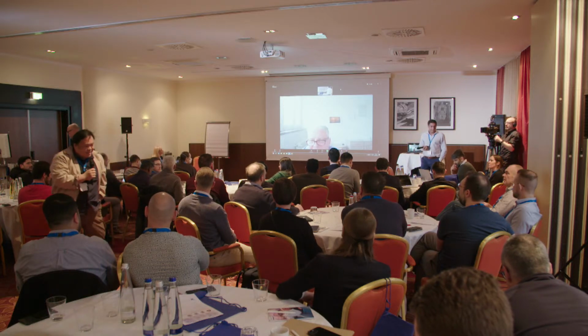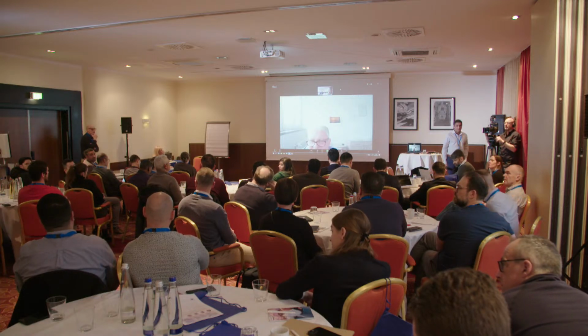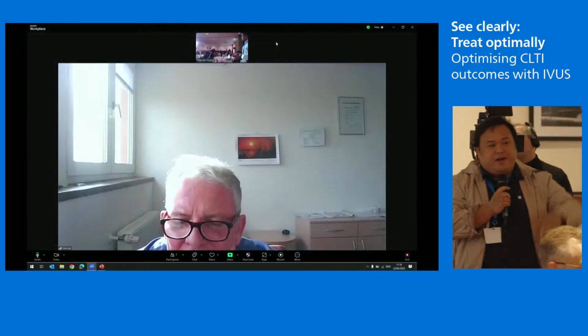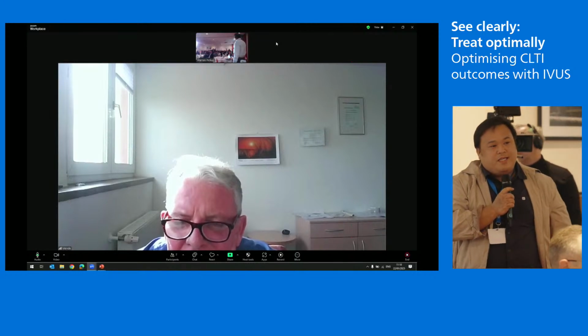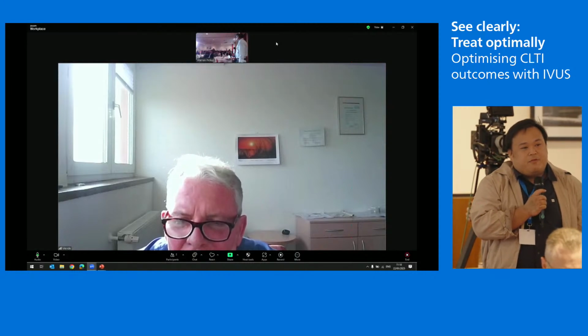Hi. Thanks for your wonderful talk. I noticed on your initial IVUS runs after crossing that there was a short segment in the distal pop where it was subintimal. I don't know if I'm correct or not. The IVUS run played quite fast, but I noticed that after crossing, there was a short segment subintimal crossing over the P3 segment. So my question to you is, laser atherectomy, can it be used for subintimal crossings? Is it safe?